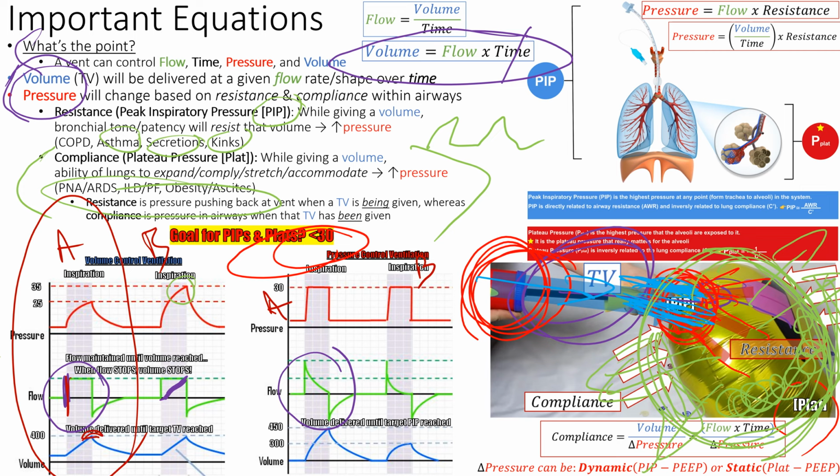In volume control mode, you are in control of the volume. You say, give 400. And it says, aye, 400 cc's, right? You get that 400 cc's, you push that tidal volume into the patient, that's going to raise the pressures of the patient, right? So sometimes we have modes, older modes, from the 90s that we use, that raise pressures, and I guess that's a consequence of being on the ventilator, isn't it?